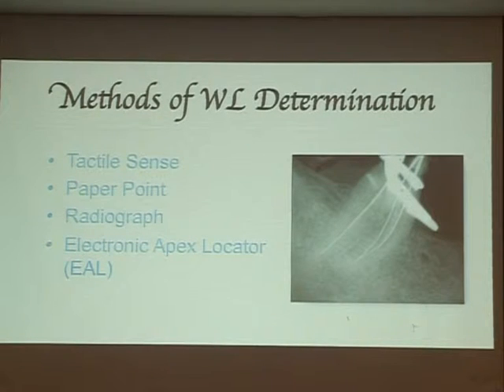Tactile sense doesn't mean that you don't give LA, right? And put a file. Ouch! This is not tactile sense. When you do 10 cases a day, you can feel the apical foramen with your file. You can feel it. You can feel all of this. So you need more training.